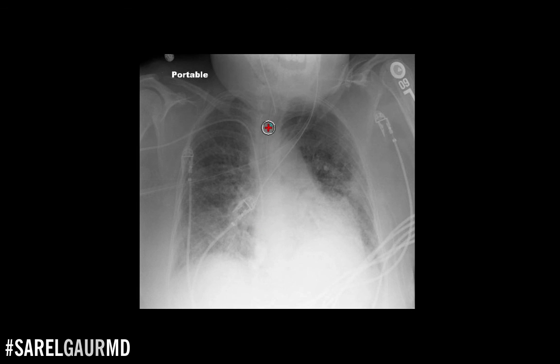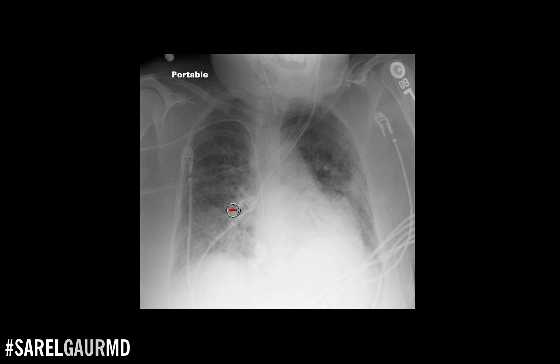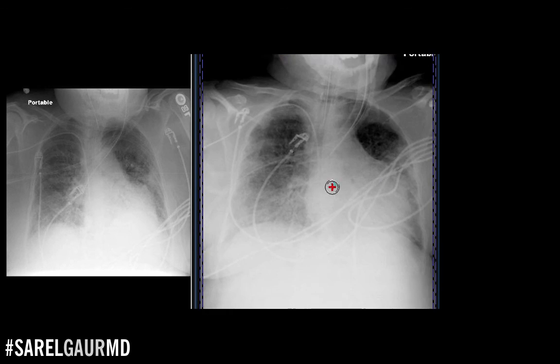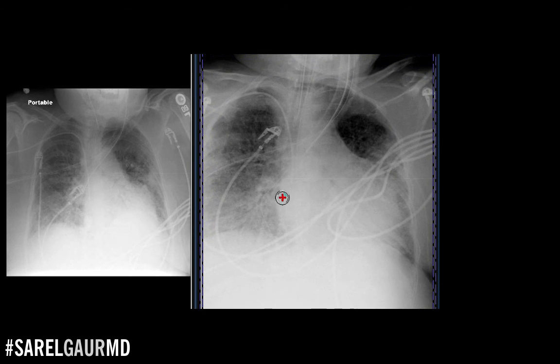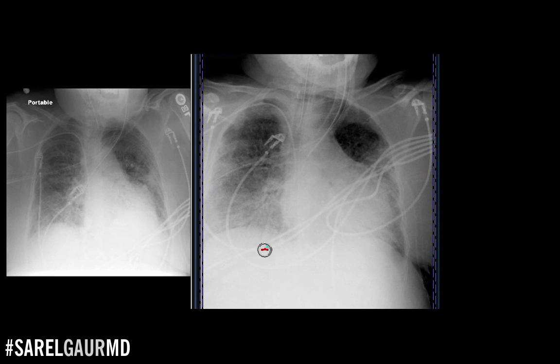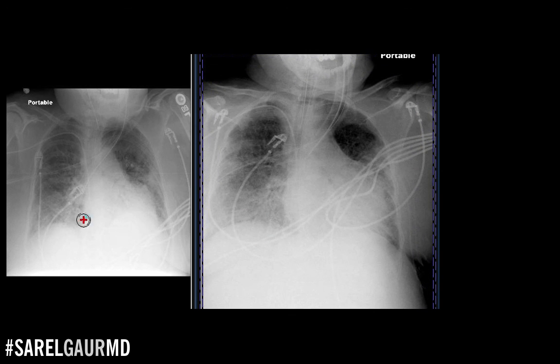From my impression, the first thing is: ET tube is up too high — I'm going to call them about that. As far as the other findings, I would compare to the prior, and when compared to the prior study, I am seeing stable pulmonary vascular congestion and at least small to moderate bilateral pleural effusions. That's my impression.